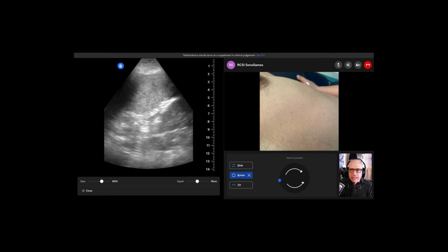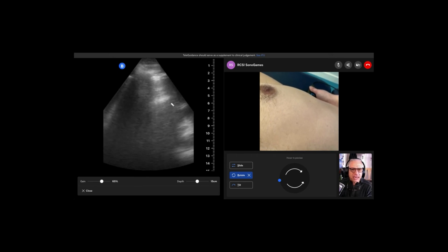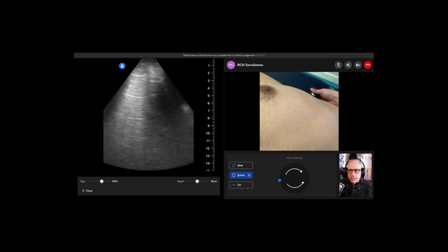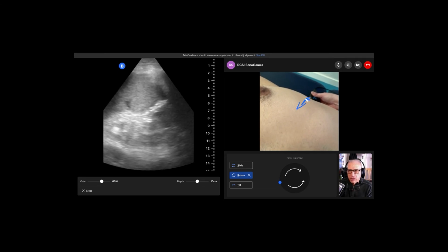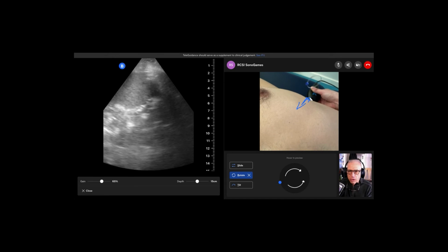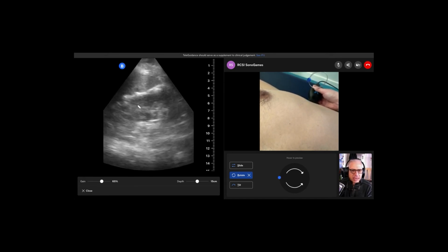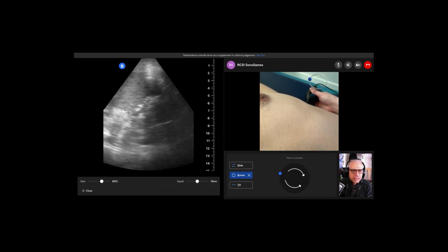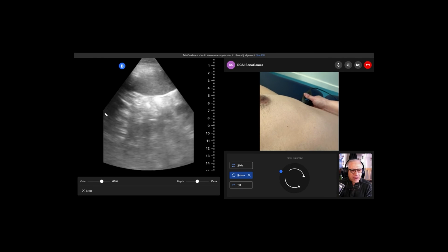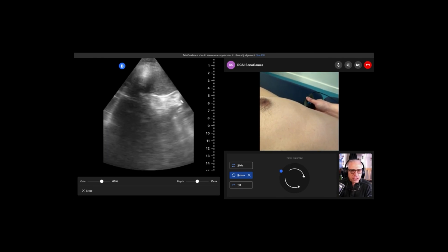And now you just want to be fanning around and see what you can get. It's getting obliterated by lung, so you might not get that diaphragm interface. So typically what I'll do here is take the transducer and go this direction on the chest, really low, and just move this way, fanning, and see if I can pick up that diaphragm and spleen. So you're getting a beautiful spleno-renal interface. That's great. And the goal is to see if you can get this diaphragm, just like you saw before on the right side.